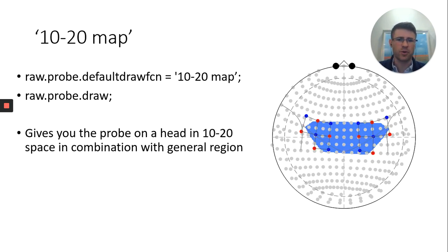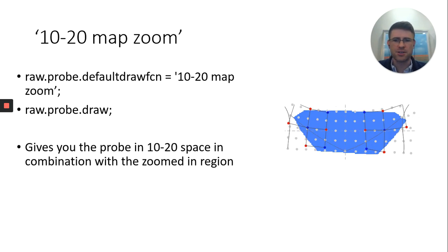There's also the 10-20 map. The map seems to cover really what the region that you're covering. So you'll notice the general region underneath the probe that you're getting. It also states red being sources and blue being detectors. You actually get a little bit more discrimination there. You can also use the 10-20 map zoom, and you'll notice now we're actually zoomed in on the probe. You see the region and only that. So it may be of interest if you're trying to actually show that in more detail.